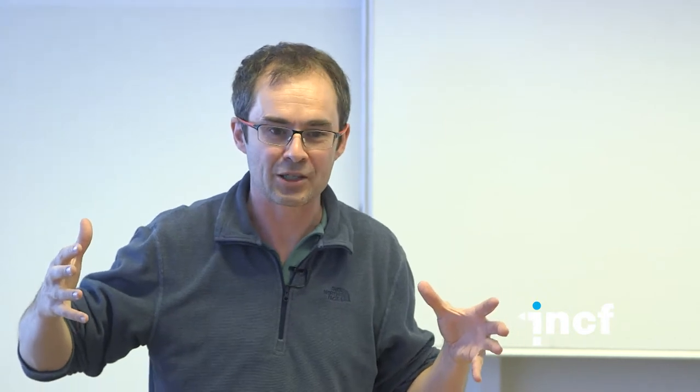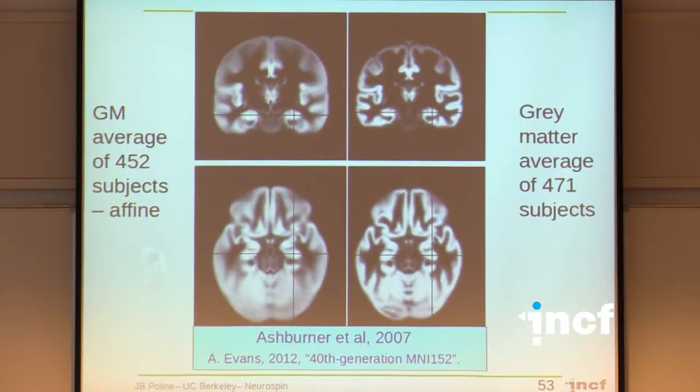That's a good study by Fischer a few years ago, if you're interested in that problem. Basically Fischer showed that doing spatial normalization using the deep sulci actually gives you a smaller variability of the cytoarchitectonic information. But still, this is the tool that we are using, and that's how much things improve with the processing.